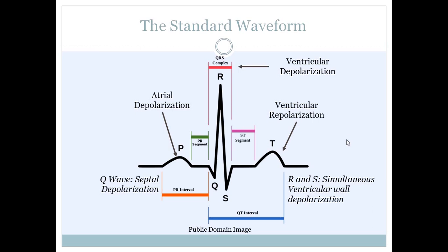The reason for using lead 2 is that it measures change in voltage from very near where the sinoatrial node is, all the way back down to the apex of the heart, and then splits the ventricles pretty much in half so that you can see the strongest peaking for all portions of a cardiac cycle.